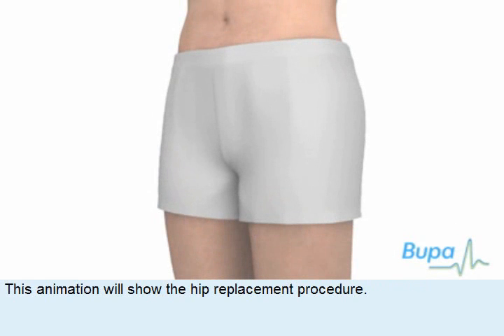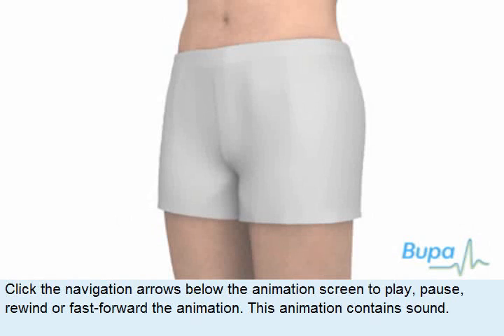This animation will show the hip replacement procedure. Click the navigation arrows below the animation screen to play, pause, rewind or fast-forward the animation.